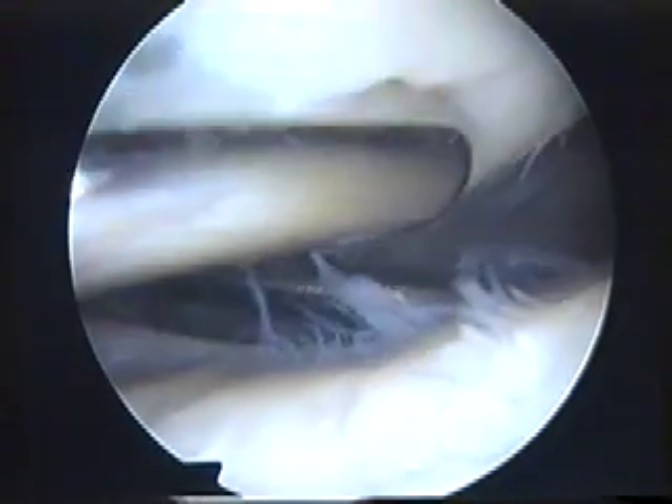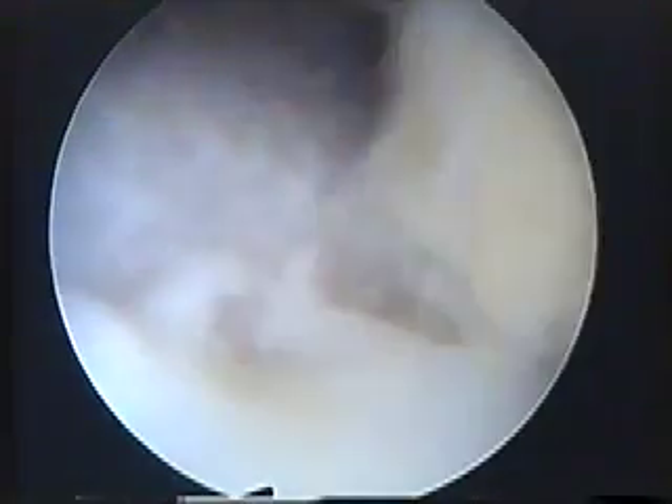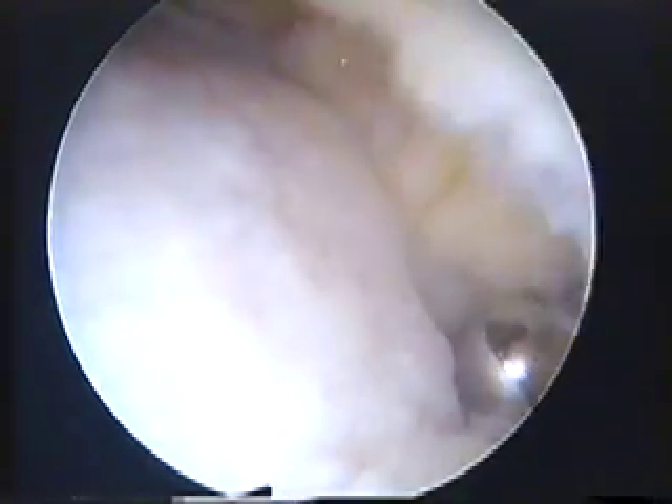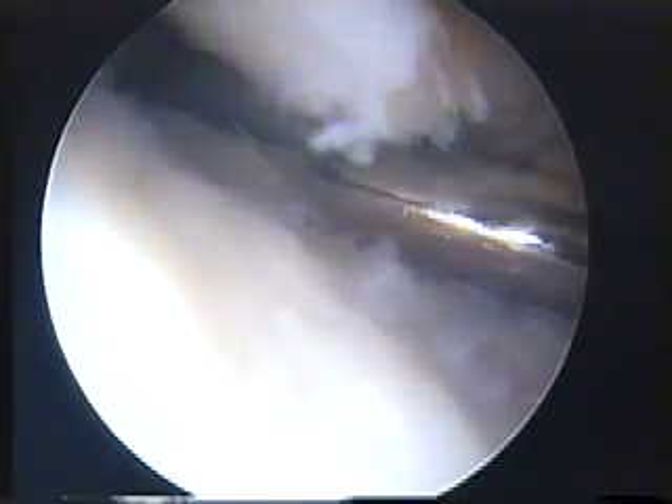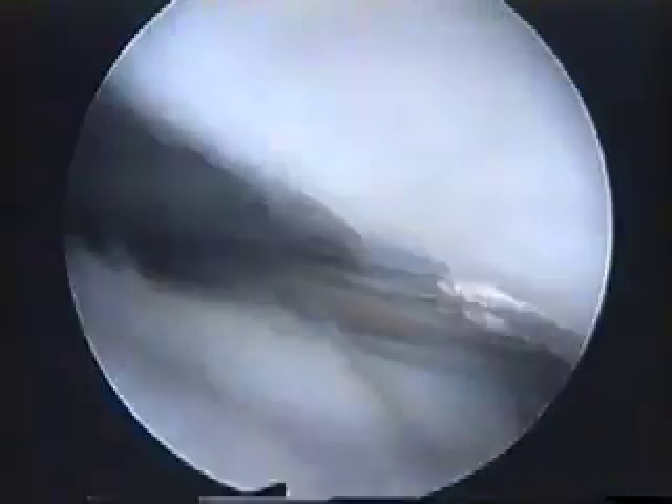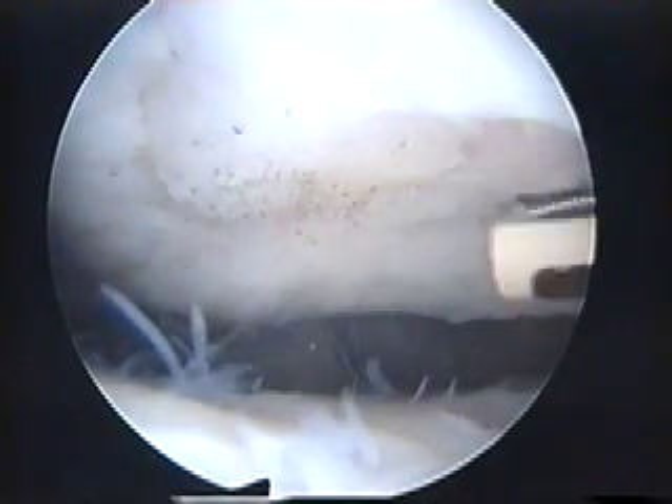Here I'm using the electric shaver to trim away all that loose material. There's no way that it can heal back into place, and removing it at this stage will reduce the amount of debris shed into the joint over the next few months. There I'm working on the patella groove, removing the overhanging flaps from around the area of damage. There's been a lot of loss of articular surface here on the patella groove and in places it's almost down to bone.